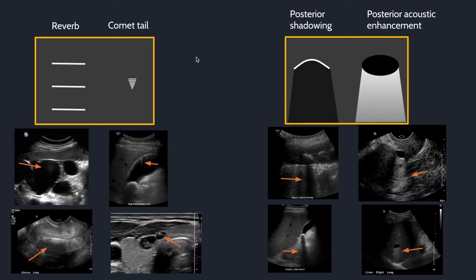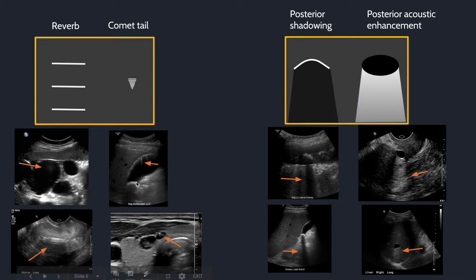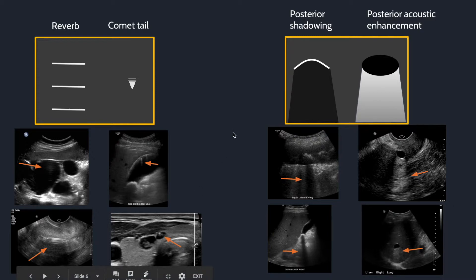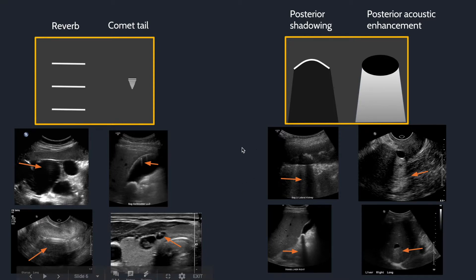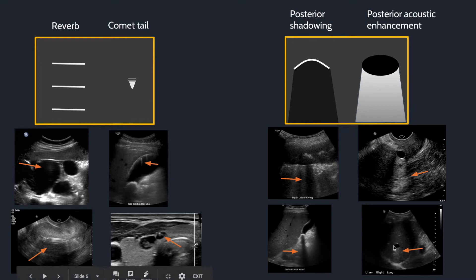Here are examples of the common artifacts. We have a reverb artifact in a cyst wall and from the IUD in the uterus. Here is comet tail artifact from adenomyomatosis in the gallbladder wall and in a colloid cyst in the thyroid. Here is posterior acoustic shadowing from a stone in the kidney and in the gallbladder. Here is posterior acoustic enhancement from a cyst in the cervix and in the liver.